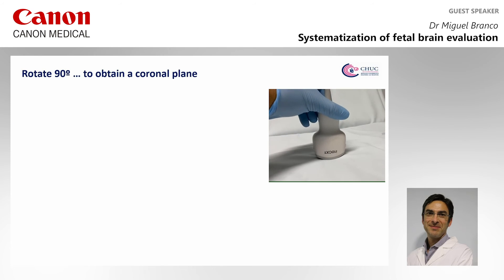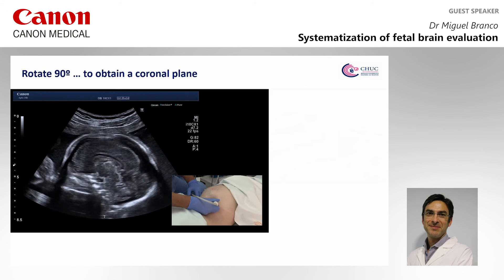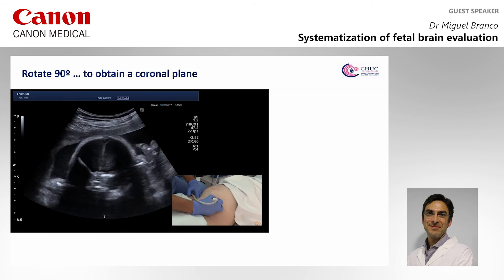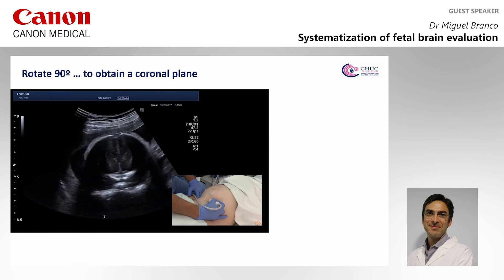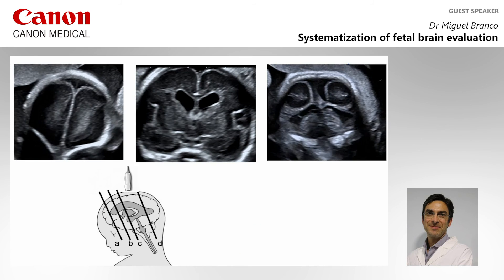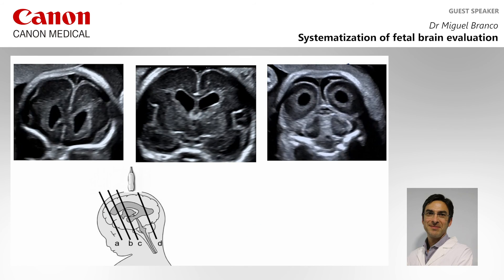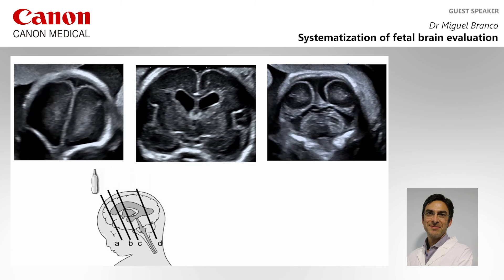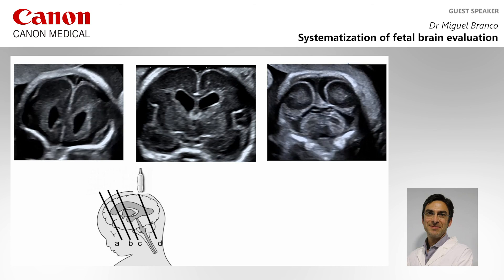By rotating the probe 90 degrees, we will obtain coronal sections of the brain from the sagittal section. You can identify the corpus callosum, the sylvian fissure, and the optic chiasma. With the combination of tilting and sliding of the probe, we will obtain all the coronal planes of the brain.